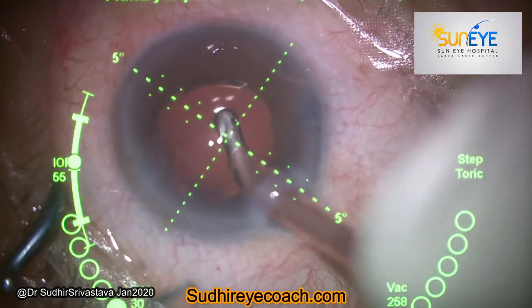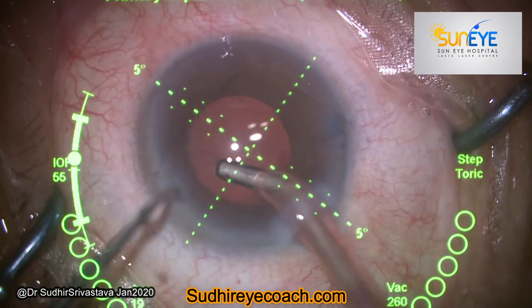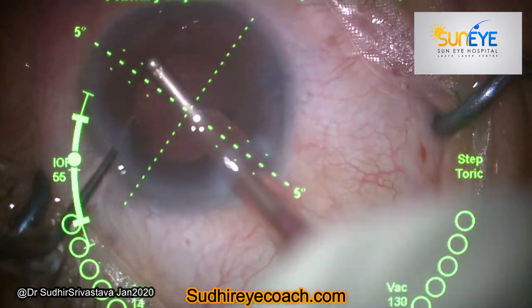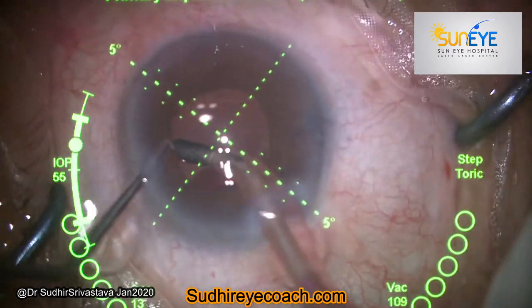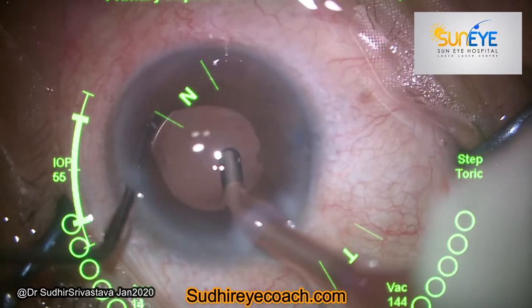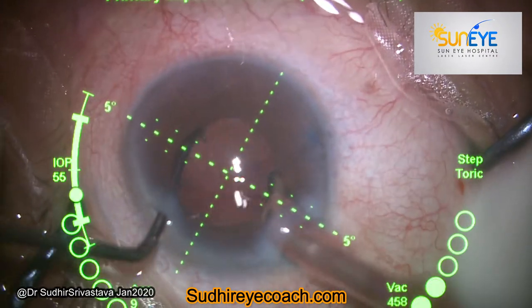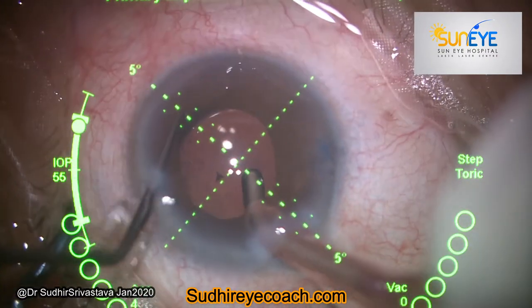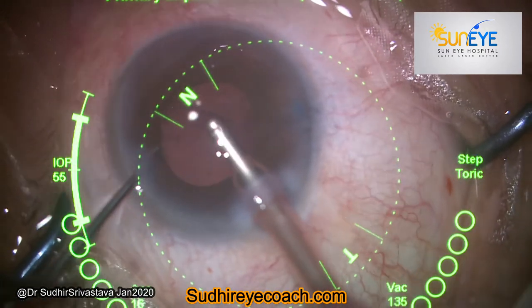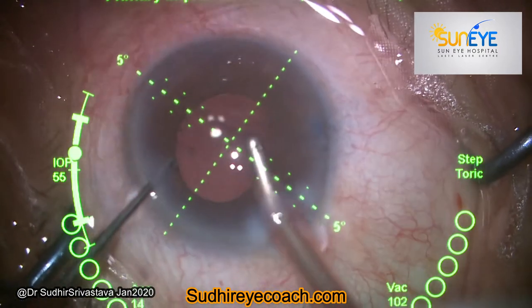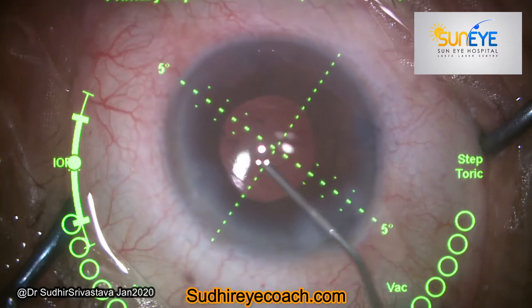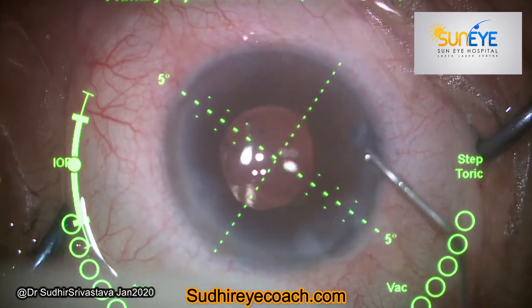Because there was no cortical matter, I was ready for implantation. I implanted a hydrophobic single-piece toric implant in the bag. Because the pupil was not very well dilated, it can sometimes be difficult to identify the exact axis placement of the toric IOL. During irrigation, you can tuck the iris with a blunt instrument to get a better view of the toric axis placement.